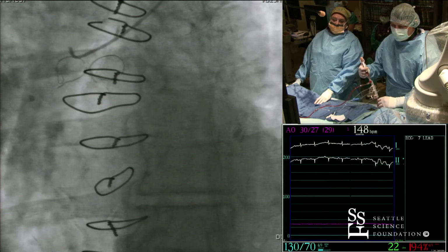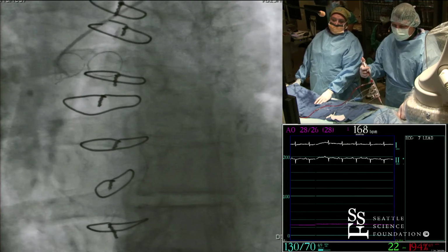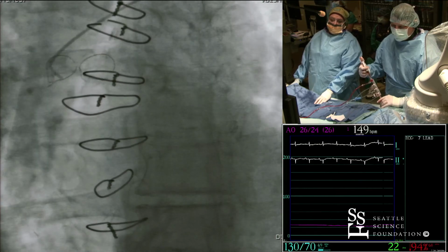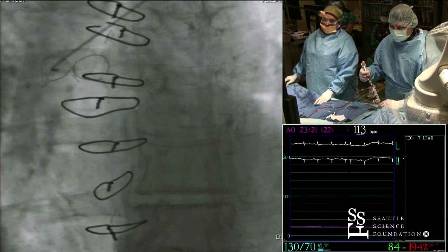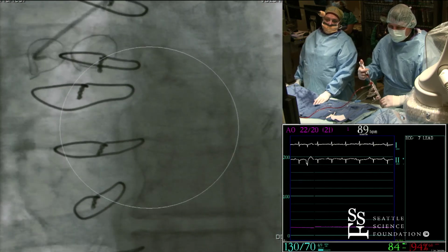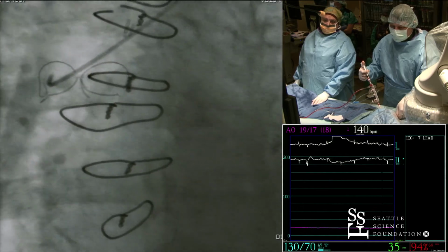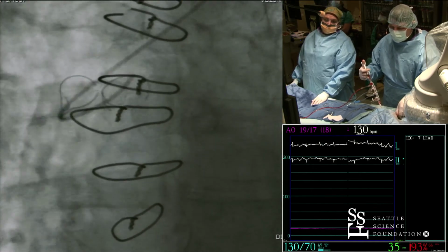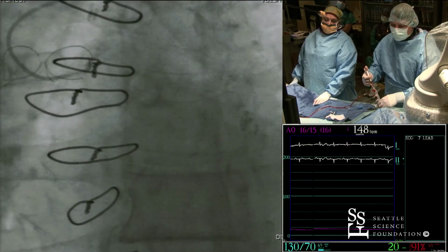So a catheter that works really well for doing the internal mammary graft is a 4 French Cordis Lima diagnostic catheter. It's got a really nice sharp bend on it, and it really likes to go into the Lima. We like that a lot better than the standard one, which has a fairly shallow angle. Find this graft here. He's going to be able to do it fine with this catheter.